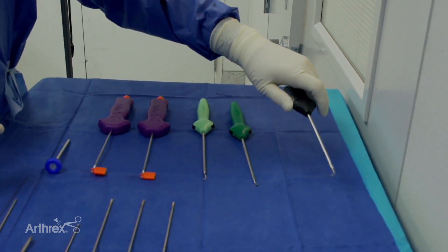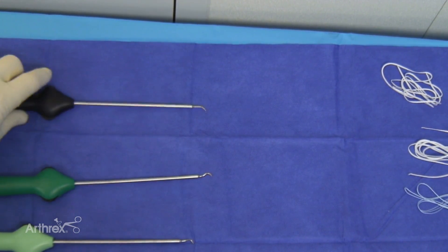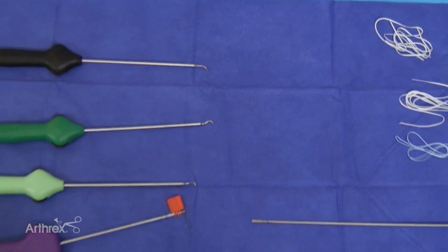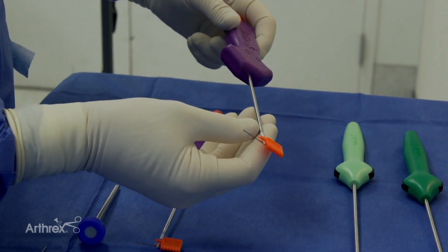We've got these quick pass suture passers that have the nitinol. You heard about the real pass — we're going to probably be using these quick pass ones today; it's another option for you. This is the push lock, the one that we use with the labral tape.